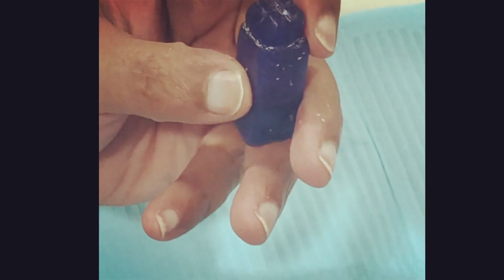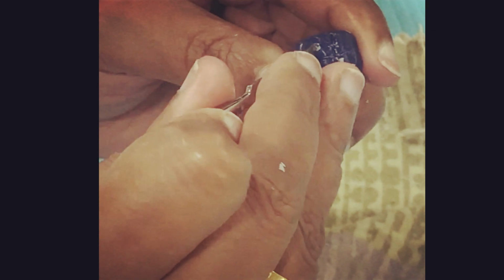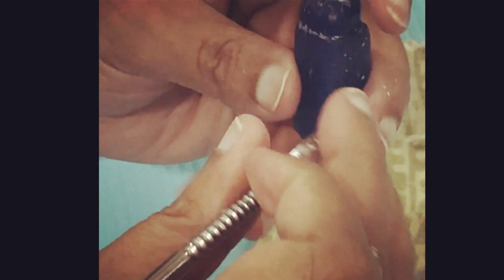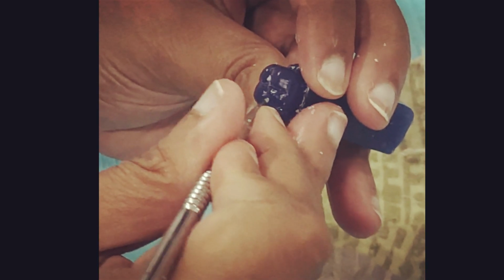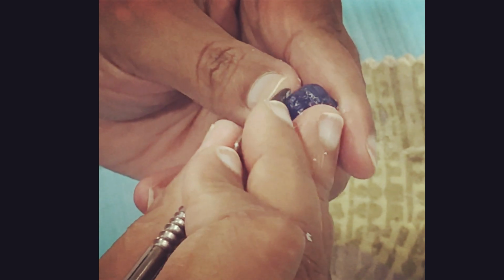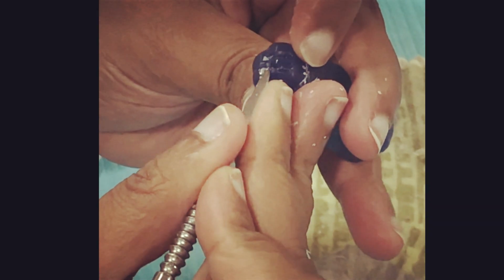Just going to take a look if I'm happy with my ridges. I want a little bit more here, so I'm going to do that. Just reduce on both the sides. Okay, and then the distal now. So I'm trying to create a small ridge for distal as well.